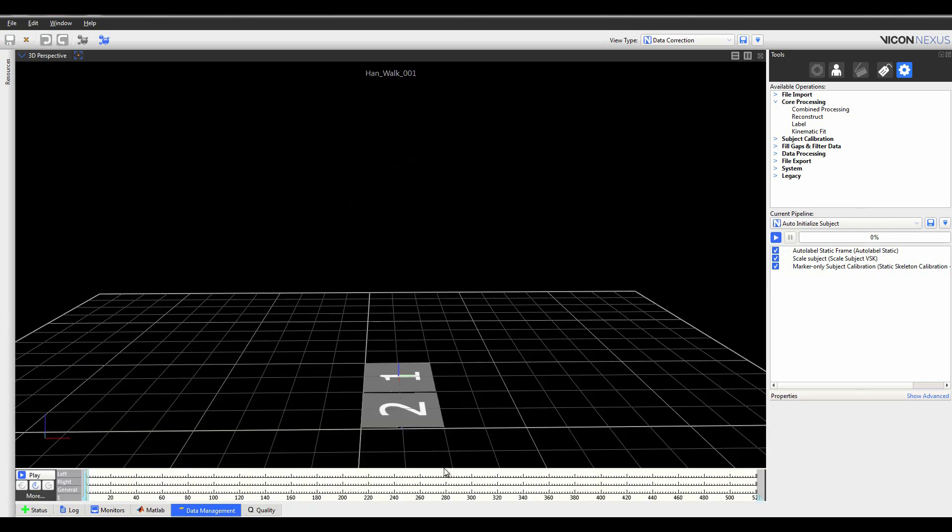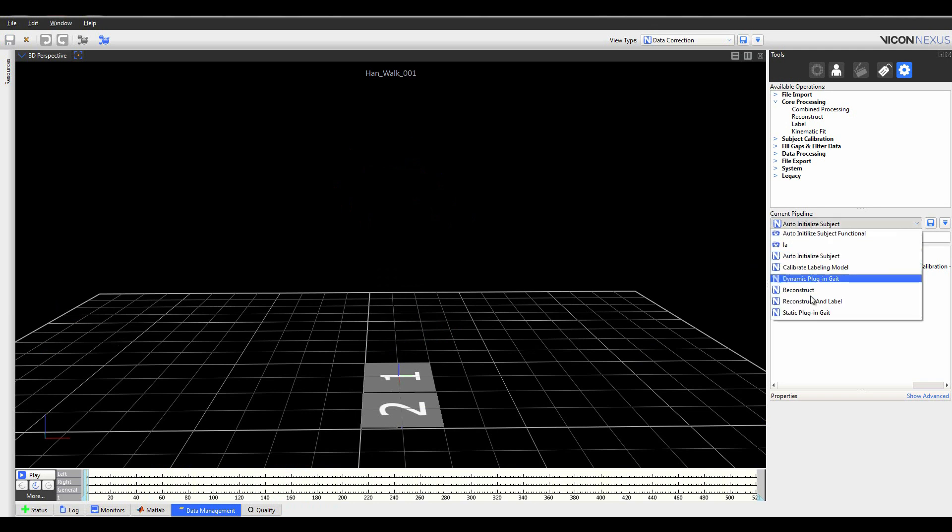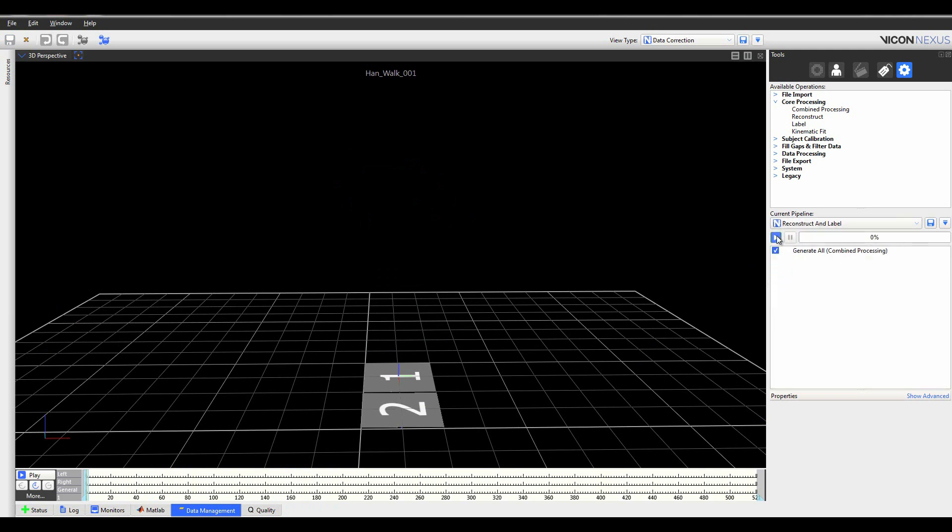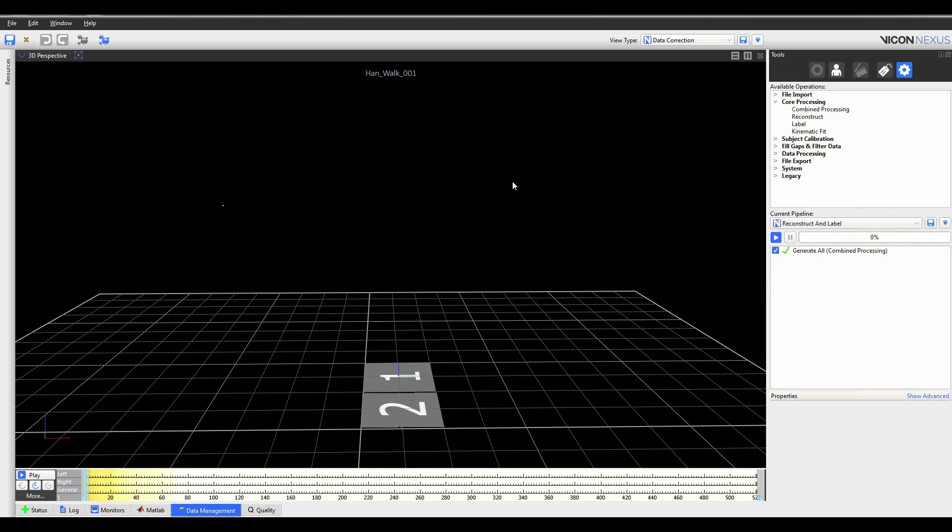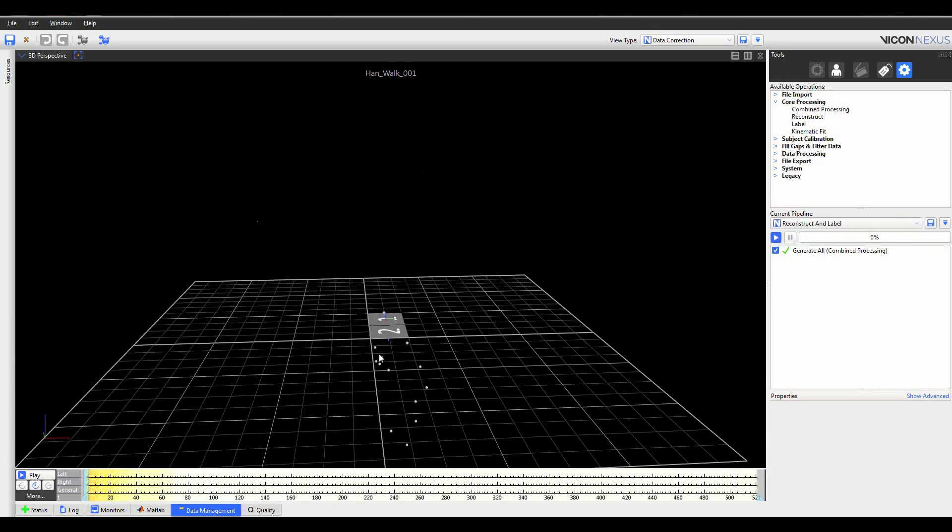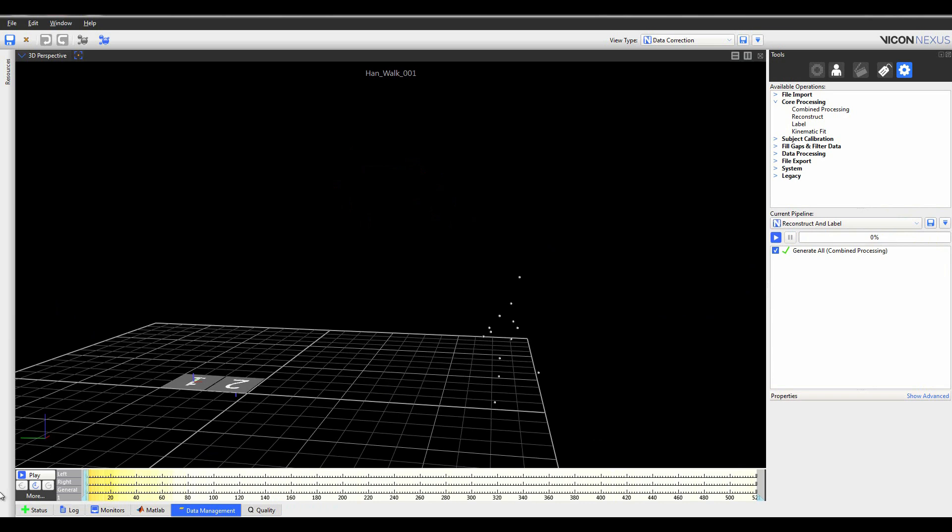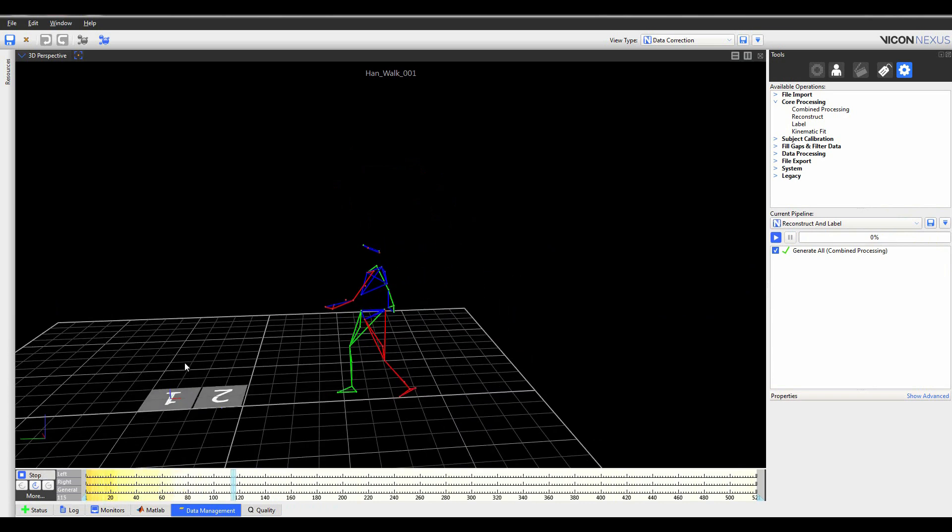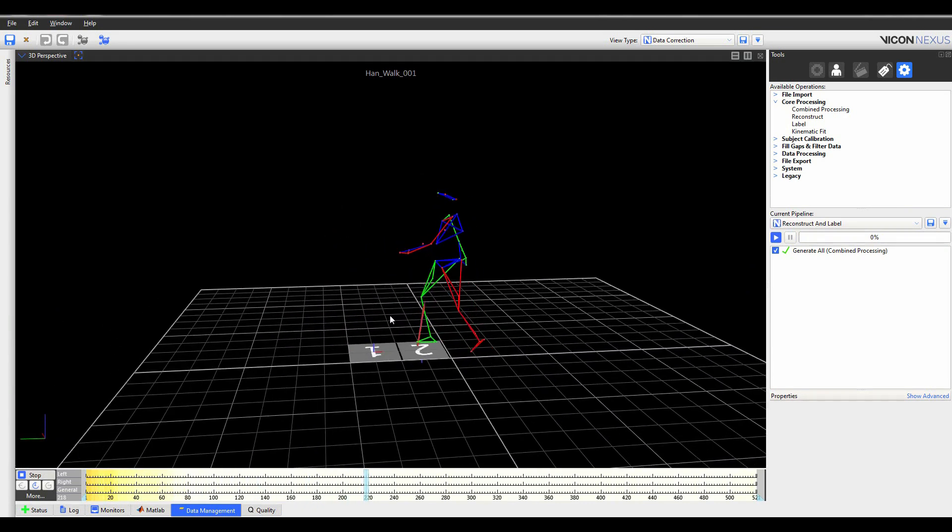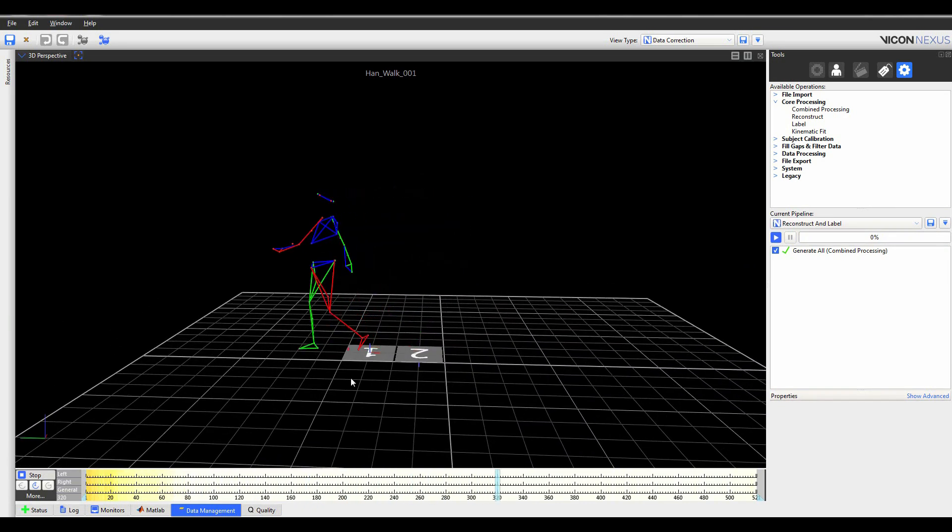The new auto-initialized subject pipeline eliminates the need for the manual labeling step that is currently required for the static trial. Meanwhile, the updated skeleton calibrator makes use of more information for a range of motion trial, producing better overall labeling.